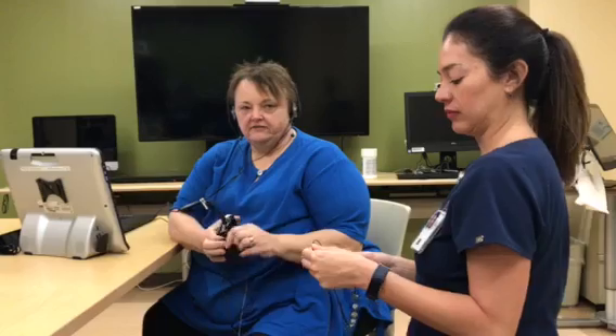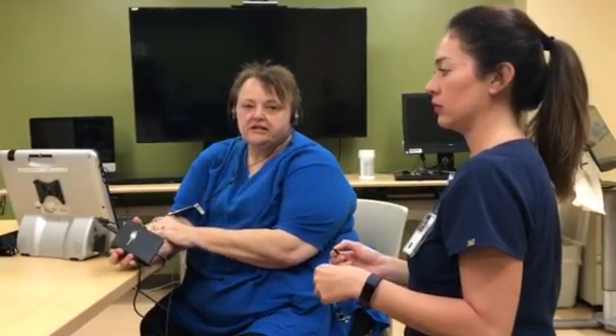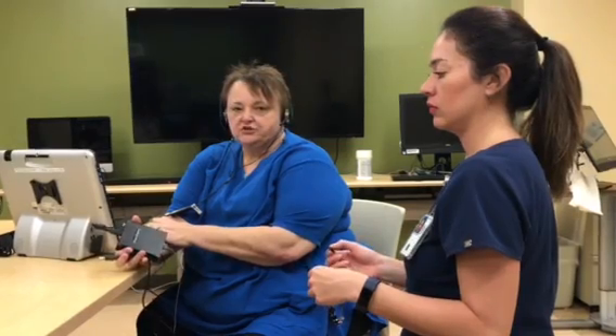This is Ursula Draper and this is Talena Caudill. We work in assistive technology at James A. Haley Veterans Hospital, and we're here today to demonstrate the Brain Fingers EMG switch control.